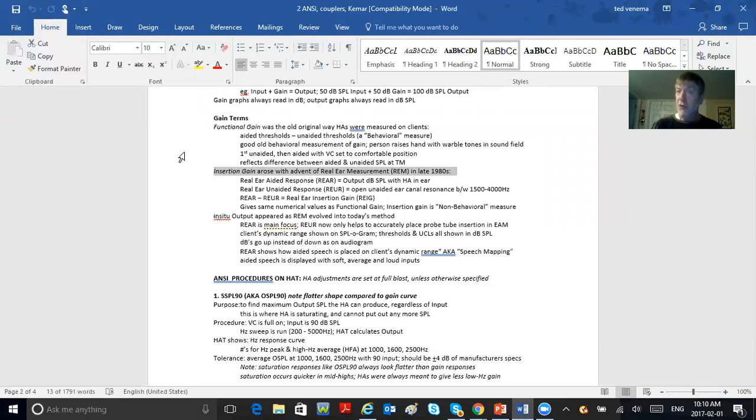I want the truth. Is the fitting method and the hearing aid delivering what I think it's delivering? What should it deliver? Well, let's use the fitting method and get a target. And that target tells you what you should be hitting, just like throwing darts. What should you be getting? Well, let's prove, am I getting what I thought I should be getting?